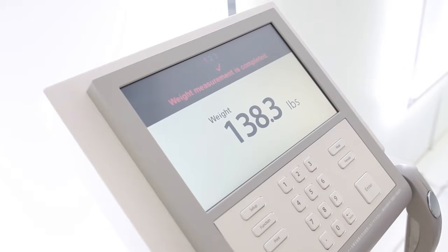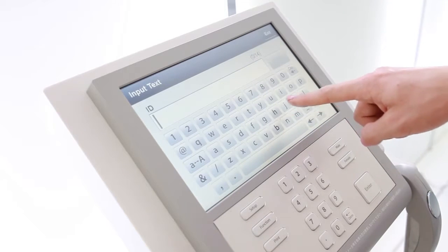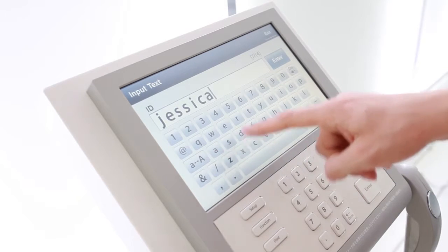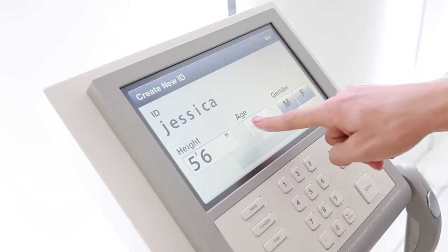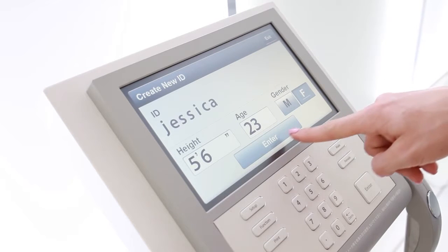Once the InBody confirms your weight, you will be asked to enter your personal profile. Using a user ID will allow you to monitor and track your progress on the InBody. Confirm your personal profile, then press enter to begin the InBody test.